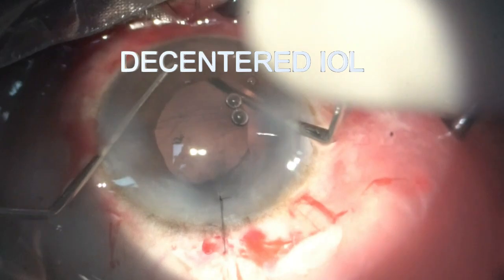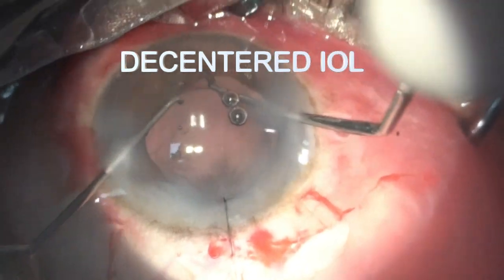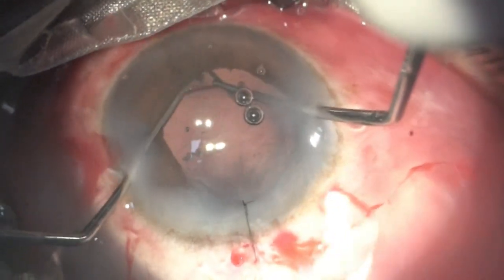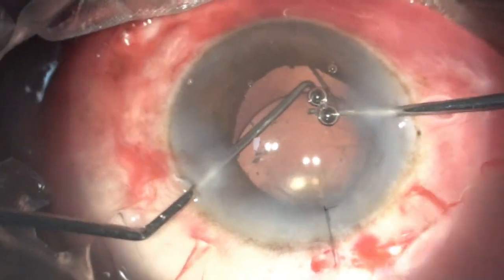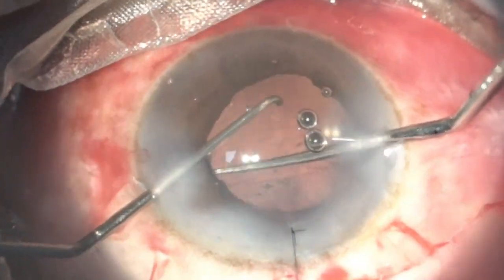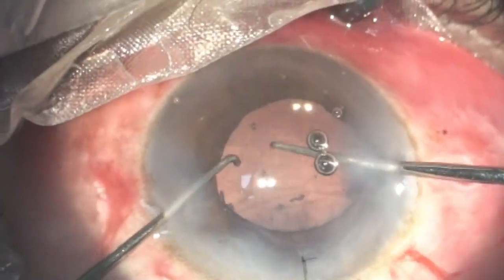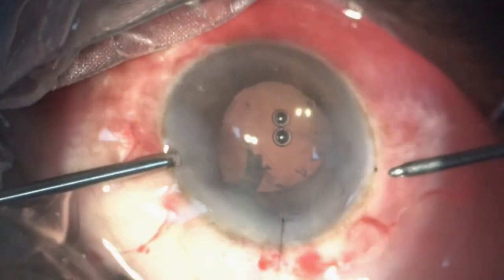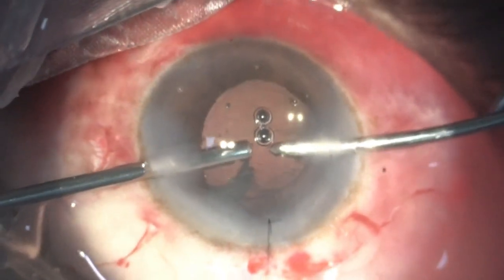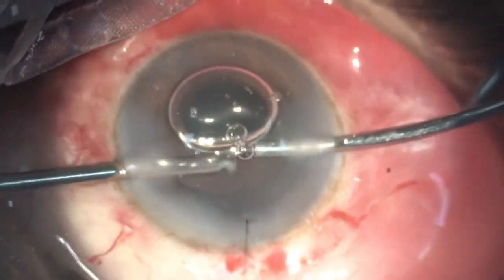This calls for an expert surgeon, where the IOL was dialed in the place and the vitreous was preventing the IOL centration. Thorough anterior vitrectomy was done to break all the vitreous strands.